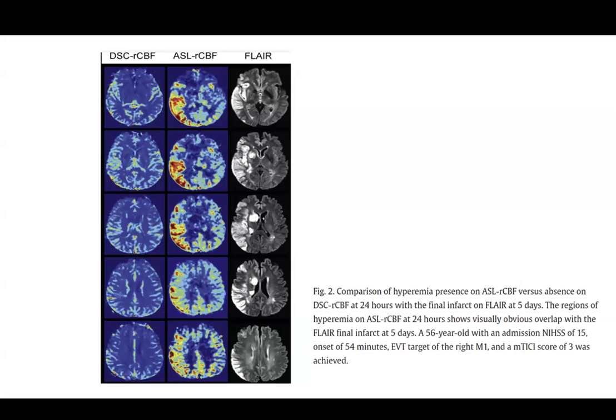Multi-delay, the problem is multi-delay is still being researched. So you have a lot of artifacts. Maybe more useful, but the real problem is that worldwide, these are all old papers.